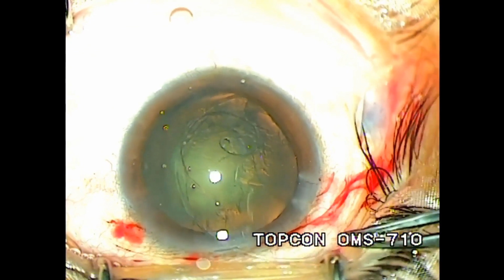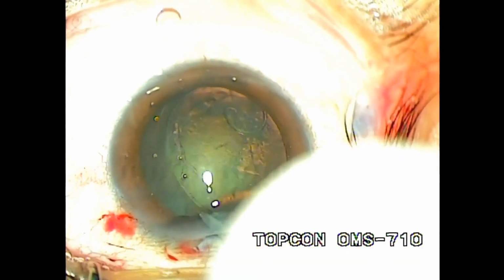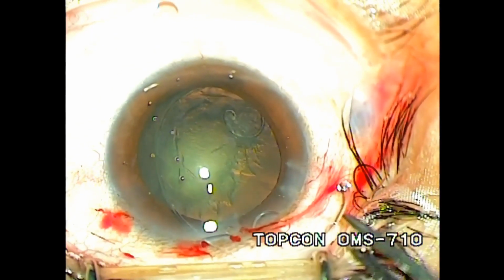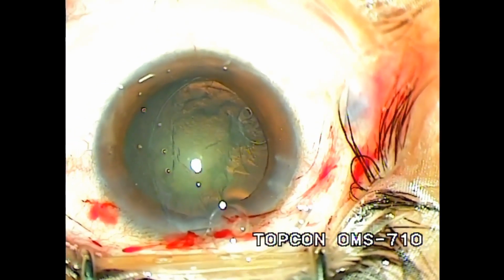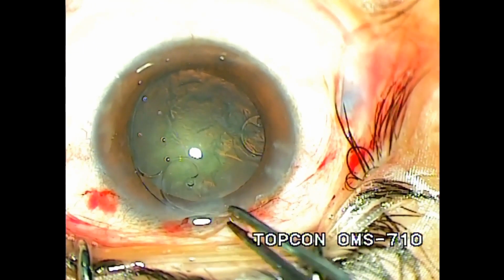The outward centrifugal force exerted by these tension rings makes the flaccid bag taut, thereby preventing the capsular fornices from collapsing towards the aspirating instrument tip. It also provides postoperative resistance to capsular shrinkage and contraction.